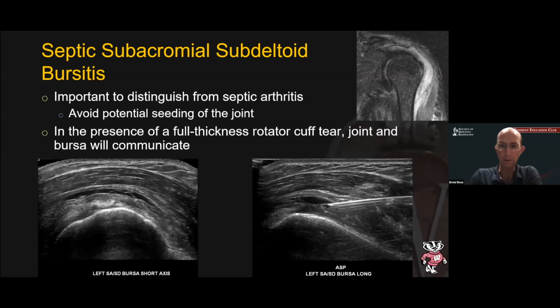So a question for you with regards to this case, when you get a request for a glenohumeral aspiration, which is sort of how this case came across, we often don't have the MR. What imaging do you request, if any, or do you just proceed with the joint aspiration? Especially, a lot of these come in after hours and are somewhat urgent, and you don't necessarily want to delay with imaging requests. What's your approach for stuff like that with imaging before an aspiration?